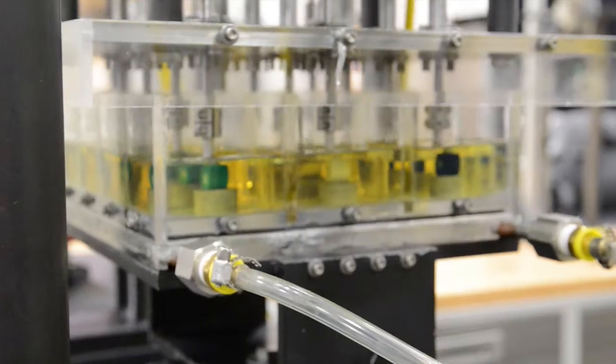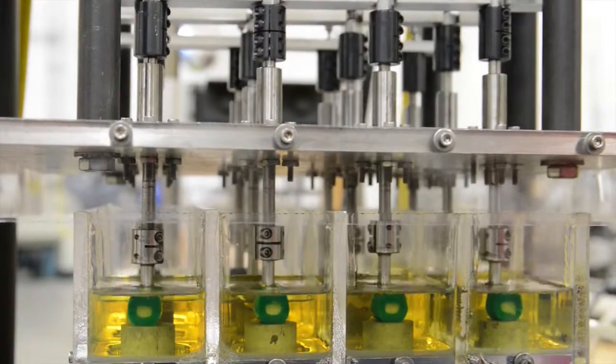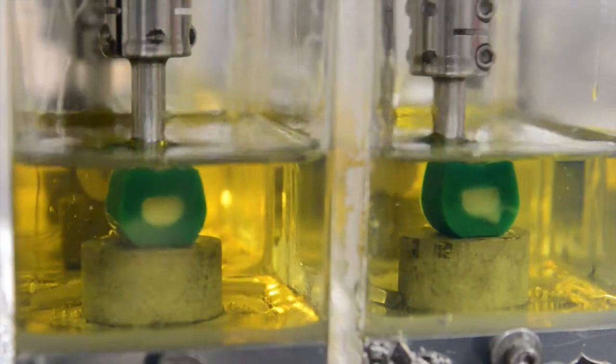We've got two 12-station pin-on-disc machines and we can perform normal pin-on-disc testing to screen materials, but we can also simulate abrasive conditions.